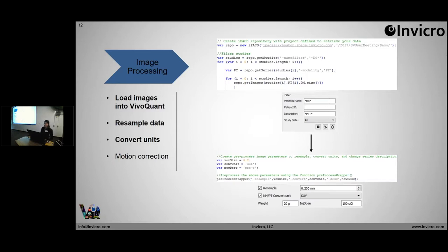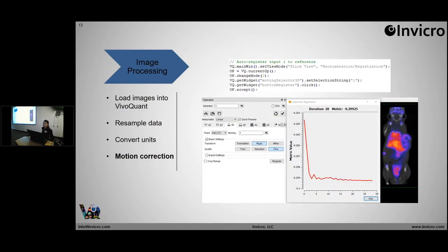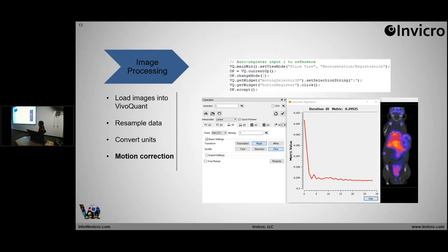Continuing on, the next step is motion correction or some kind of registration. You can execute automatic registration in VivoScript. What I showed at the top is how you would do this same thing through a VivoScript — you can see it's really short, only a few lines, and it executes this automatic registration.